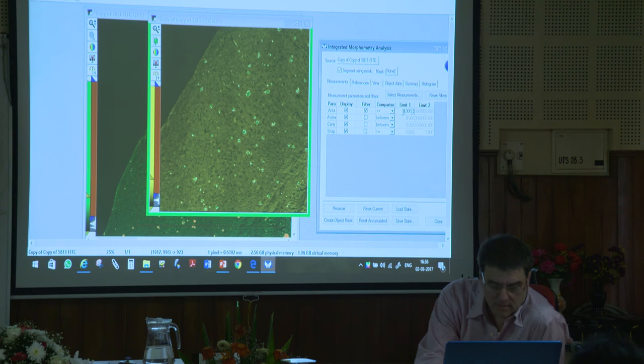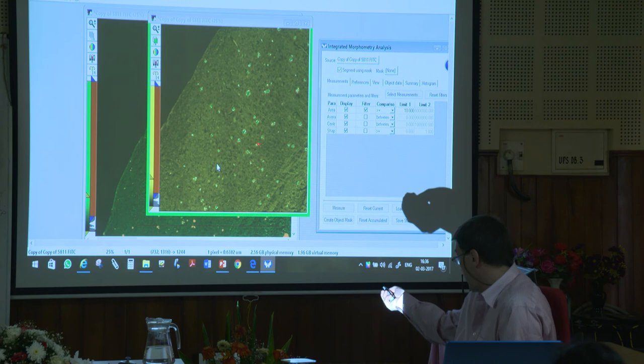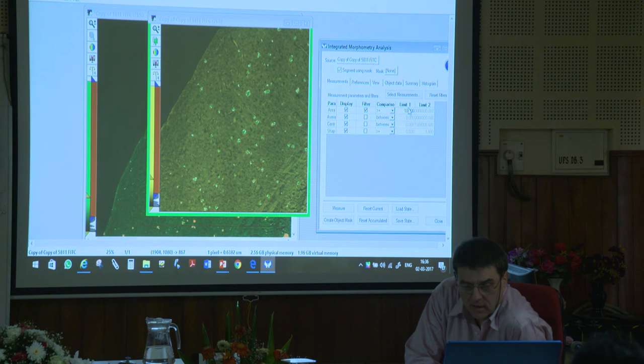Maybe I don't want anything under the size of 10. Okay, so see what it did? See how it turned real little ones orange? It threw the really tiny stuff out because I wouldn't call that, well, it's hard to see that. Let's make it bigger. We'll never see it. I could see it up here, but barely. Let's say 100.